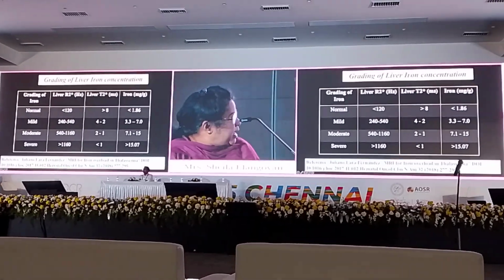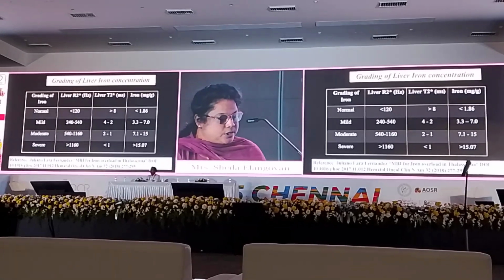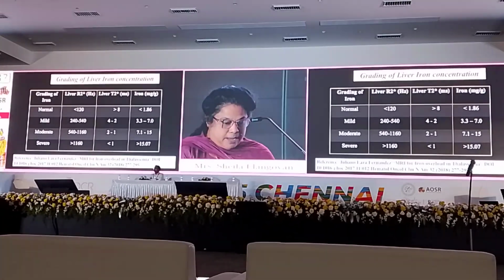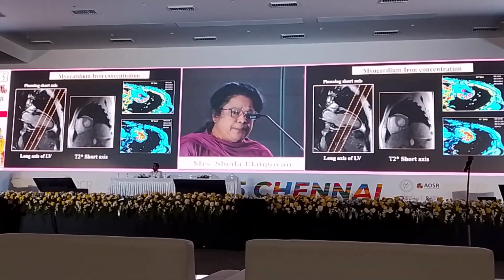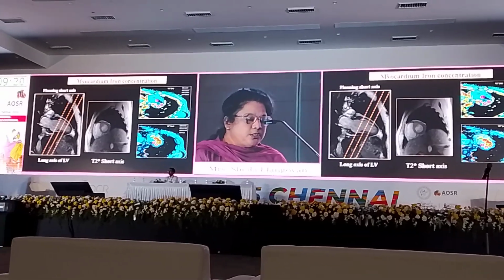Based on that, for the grading, you get the R2 star in hertz, the T2 star in milliseconds, and the iron content in milligrams per gram. So this is also done in the myocardium, yes, in beta thalassemia patients and chemotherapy patients, where there is iron overload and every time a biopsy is not feasible.